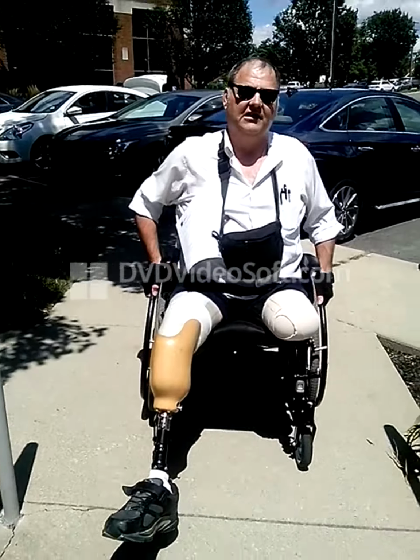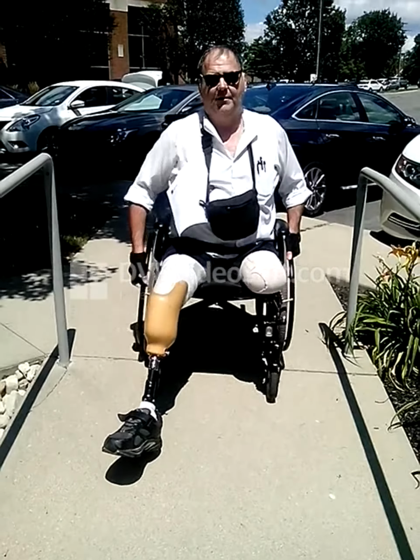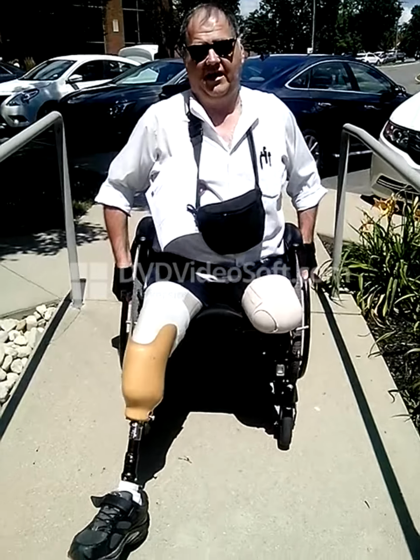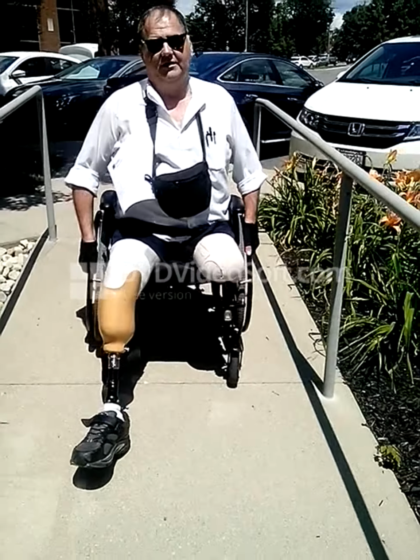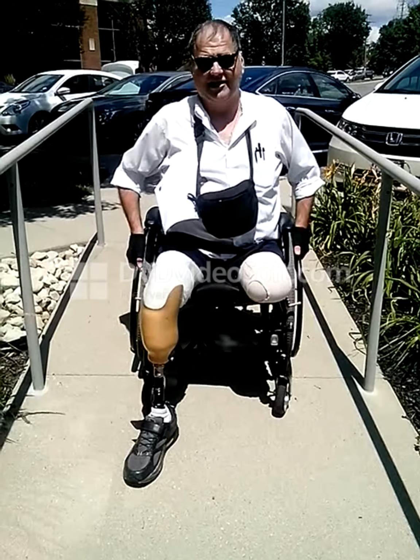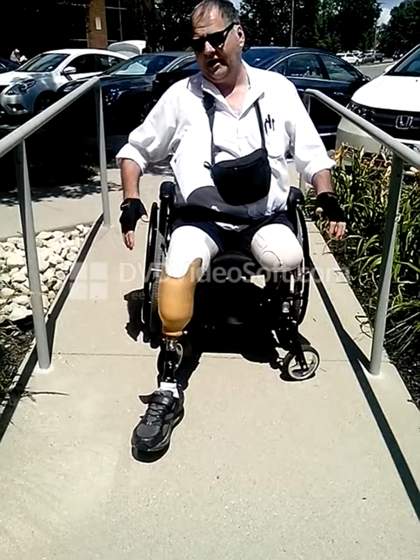I can still do this when I don't have any prosthetics on. When I have no prosthetics on, though, I want to make sure and hold on to my wheels all the time, because if they get loose, I'm going to be in a bind. I'll just go downhill uncontrollably. But since I have one prosthetic, this works out great, because I can actually stop myself on the ramp using my foot, not using my brakes.